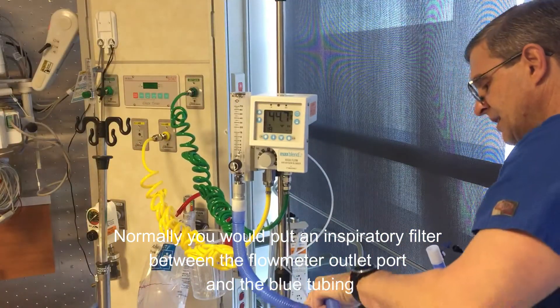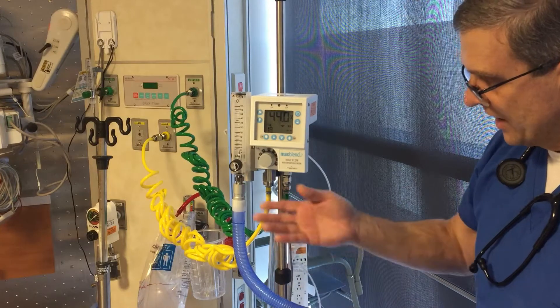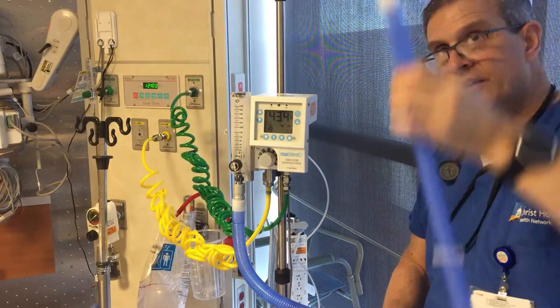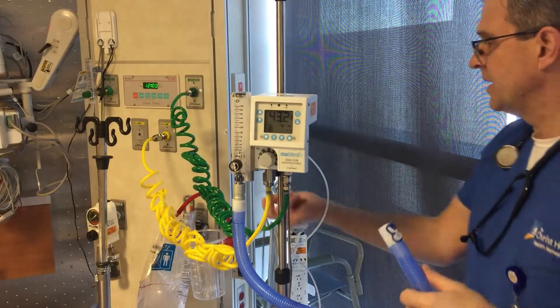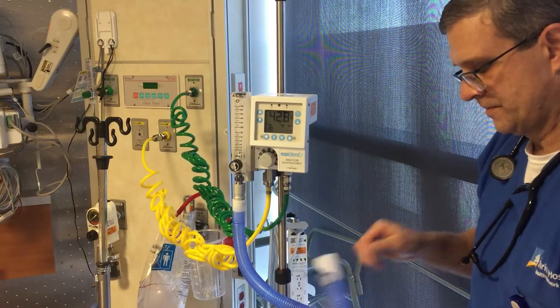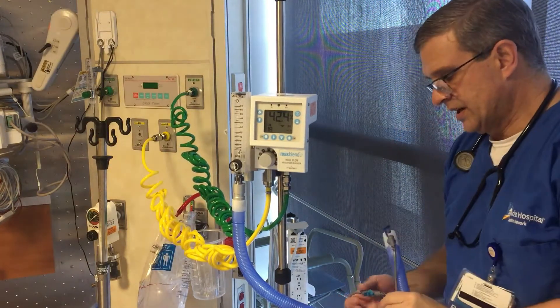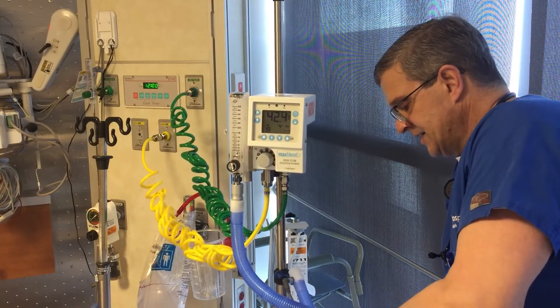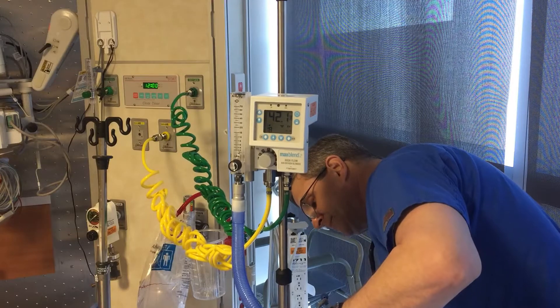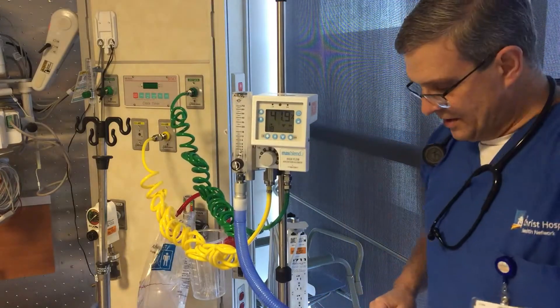We have a single limb circuit. What's going to happen is it's going to blow the oxygen over the heated water here and then deliver it to the patient. This actually does have a heated wire in it because we want to keep it super humidified, so we need a temperature probe. We're going to measure temperature at the distal port, put this temperature probe at this end, and then plug in our heated wire so that it gets hot.